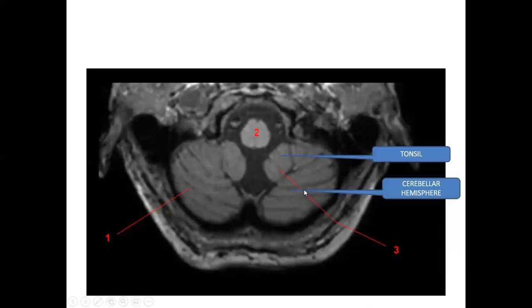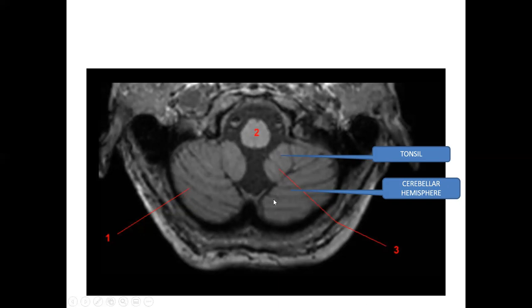Looking at the cerebellum, going from the bottom upwards: this is the medulla, these are the cerebellar tonsils, and this is the cerebellar hemisphere. There are two cerebellar tonsils and two cerebellar hemispheres on each side.